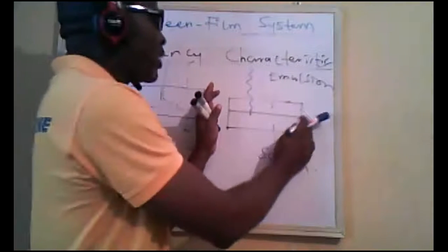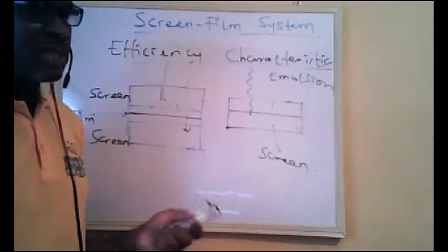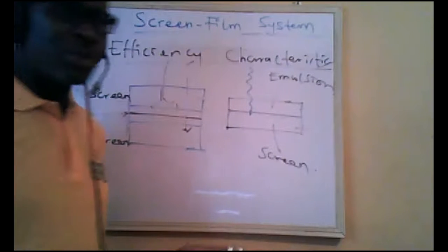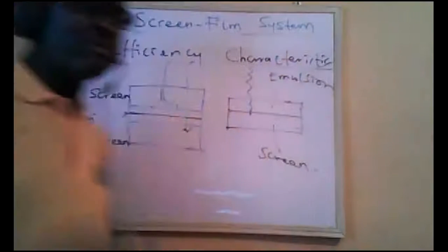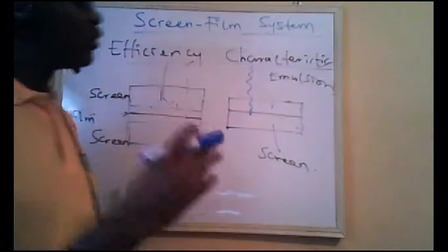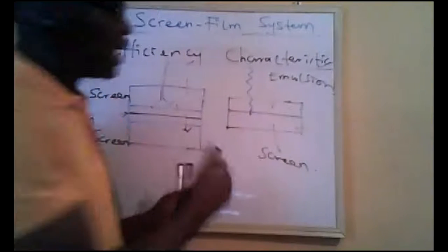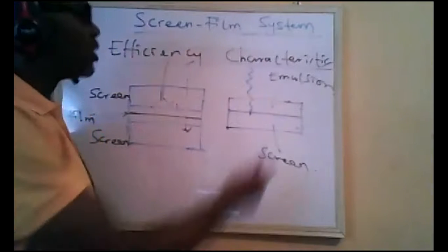But our main concern in mammography is seeing any tumor inside the breast tissue, and microcalcifications and so on, which have very similar contrast and properties. So it is good for us to have a very good system that will be able to distinguish between these abnormalities. That is helped by this configuration.